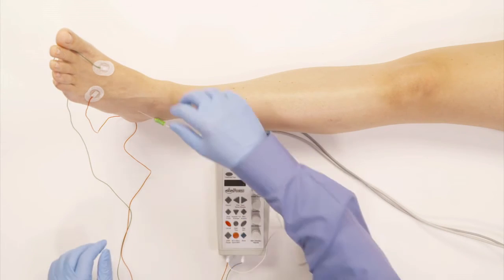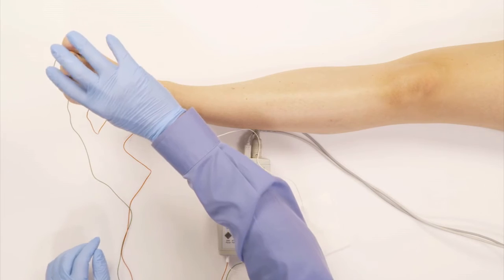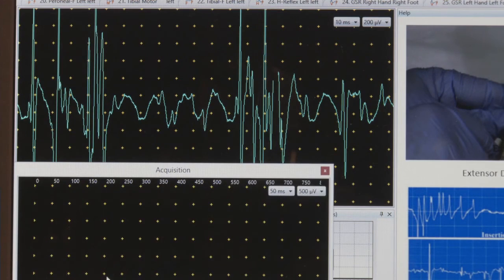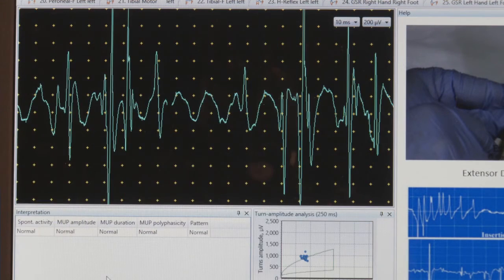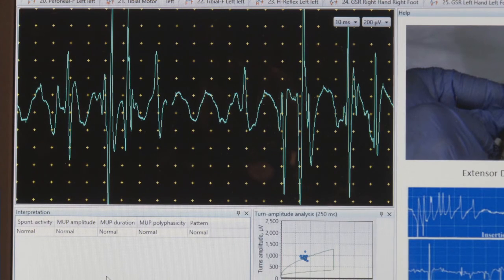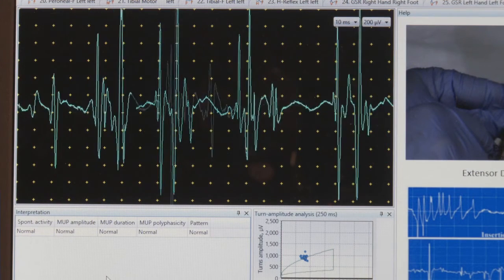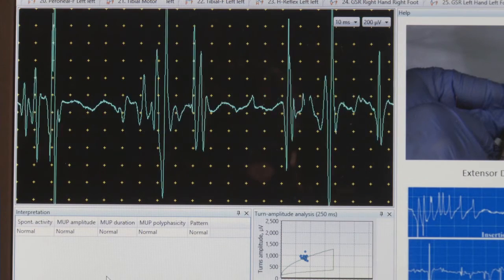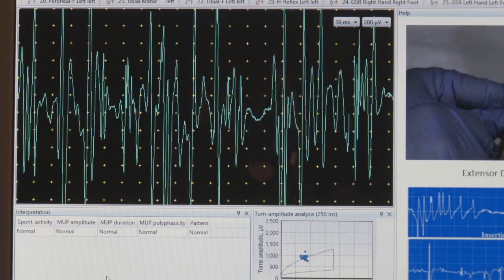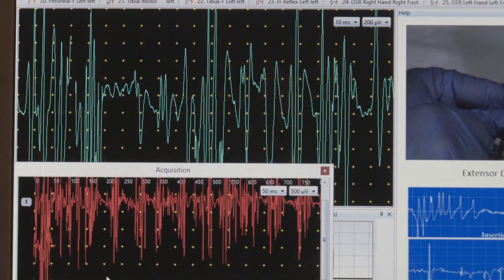And so I'm going to start pull up, I'm going to start acquiring. As soon as I've done, I press this here. And now I see the dots right a little bit outside the muscle. Now I ask her to put more activation. Here we go.